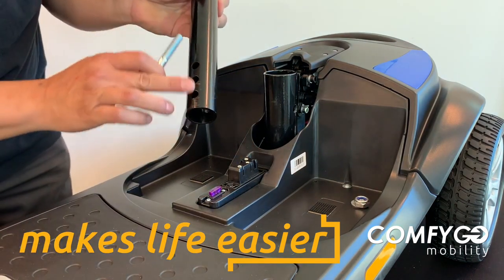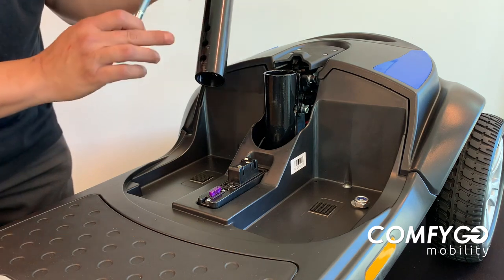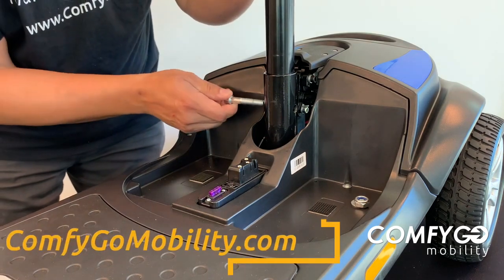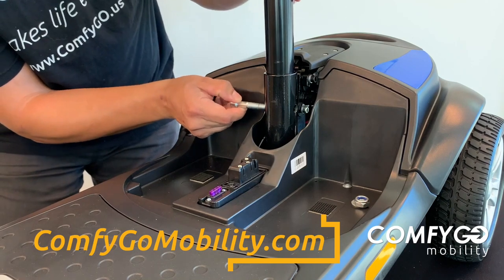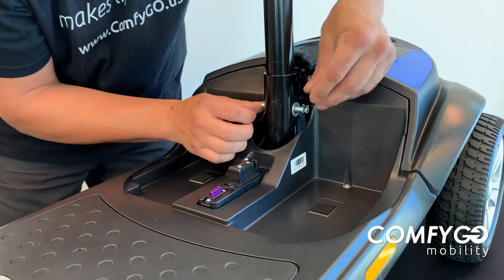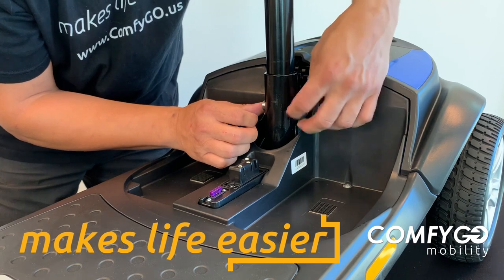Now our shaft has got three selections here for seat height, so you can adjust it about an inch between the three seat selections. Push this down into the shaft here, and let's insert our bolt the same way we took it out. Let's line it up, push that in until it goes all the way through, get our washer on, get our nut on there, and hand tighten it until it stops.